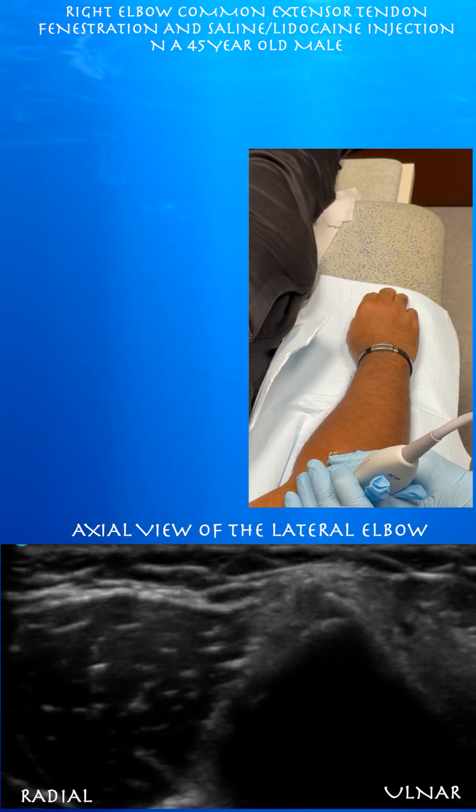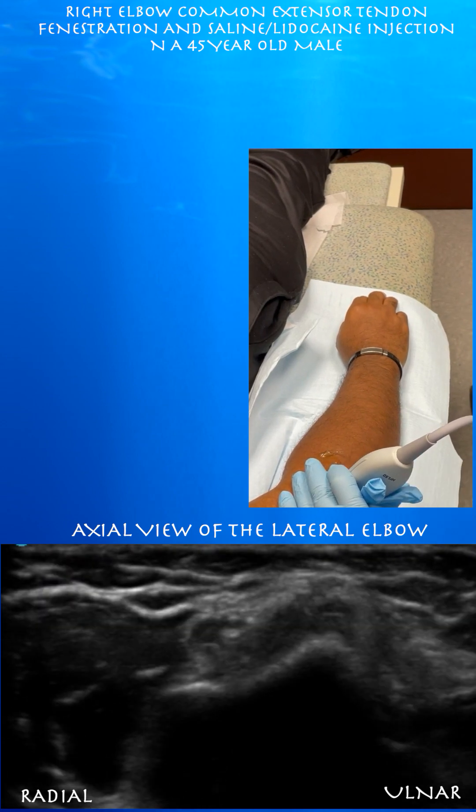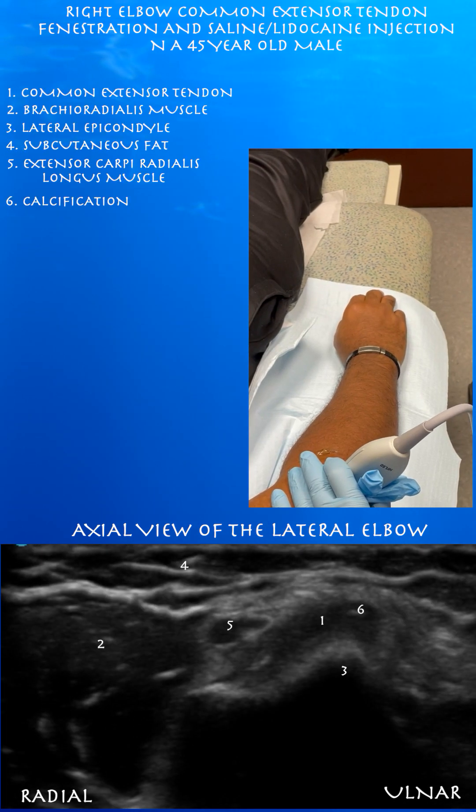On the right side is ulnar. Here again, we're looking at the lateral epicondyle and we can see that black zone with some calcification. Here again is that point calcification within the common extensor tendon with some surrounding tendinosis and intrasubstance tearing. Here you can appreciate the extensor carpi radialis longus muscle in addition to the brachioradialis muscle.